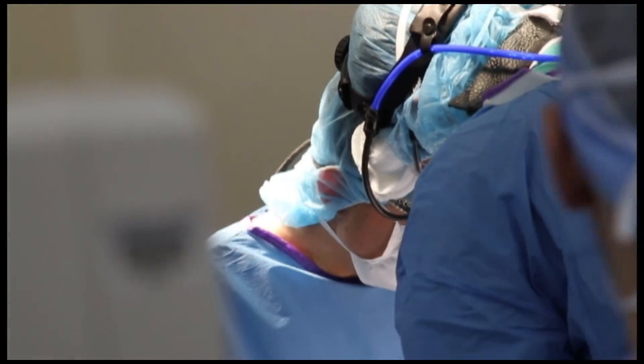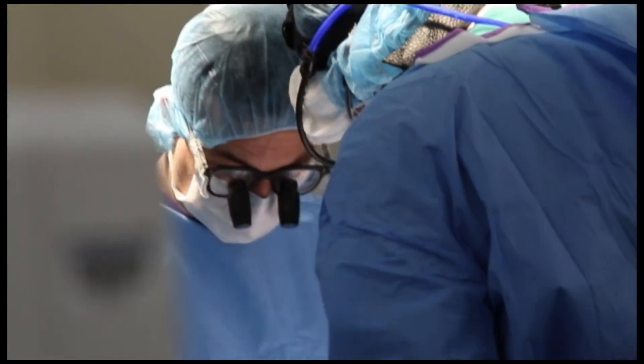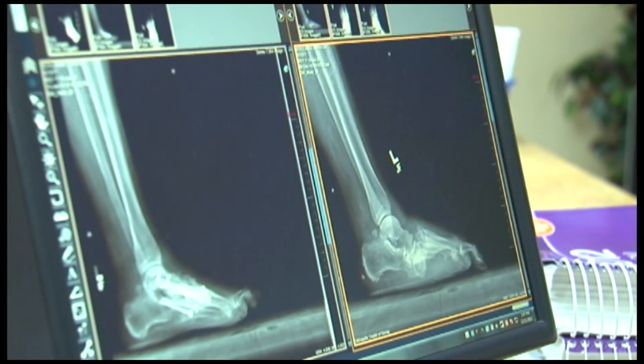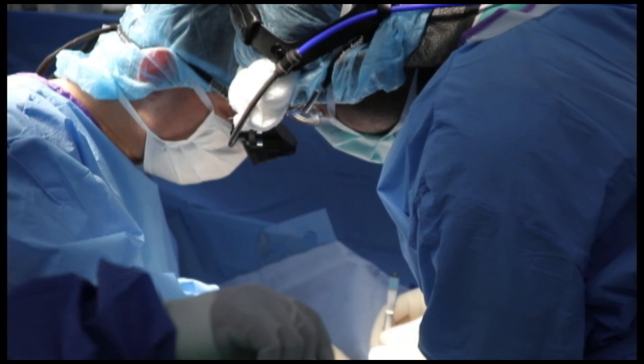A new twist on ankle surgery is helping people with damaged tissue or a severe sprain get back on their feet in record time. The historic procedures involve an open incision with a lot of suturing. There's this newer procedure to do it minimally invasive, and we combine it with an ankle arthroscopy — a little camera into the ankle with instrumentation to repair the ligament through three small puncture incisions.